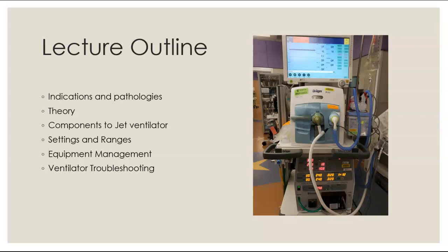So as you can see here to the right, I have a full picture of the high frequency jet ventilator. And you can see that essentially what we're doing is running two ventilators at the same time. We have a conventional ventilator, which in these presentations you might see as a CV, and then the high frequency jet ventilator below, which is manufactured by Bunnell.